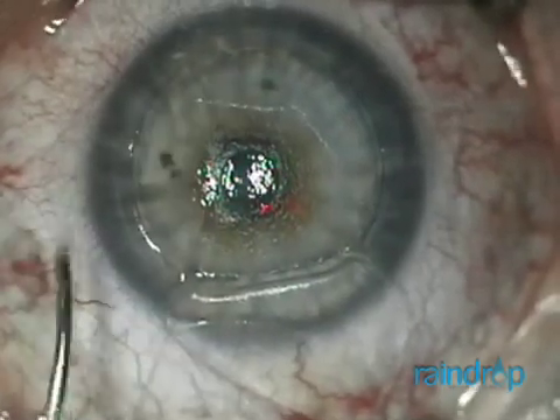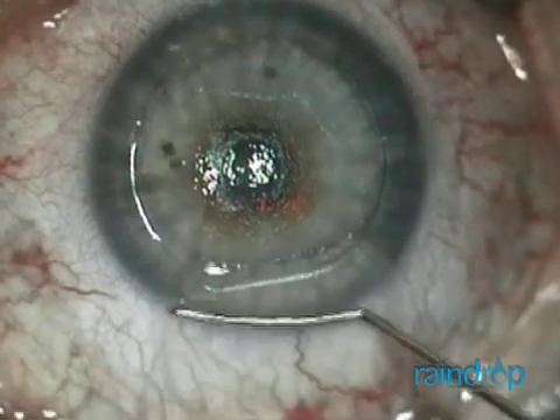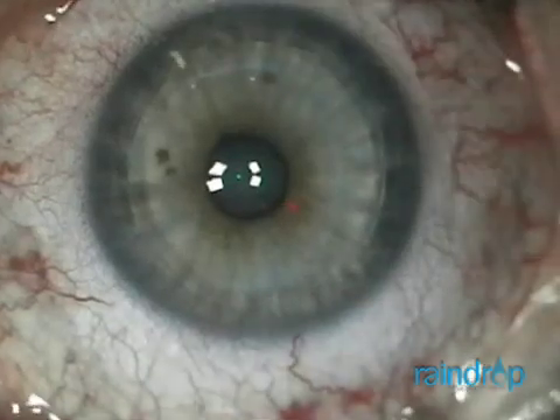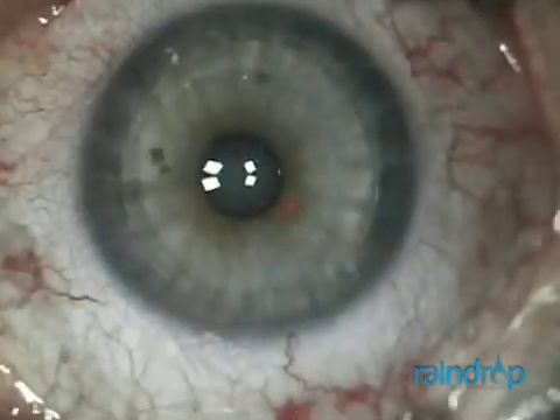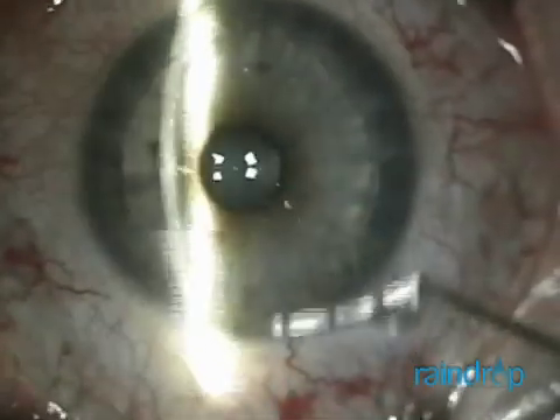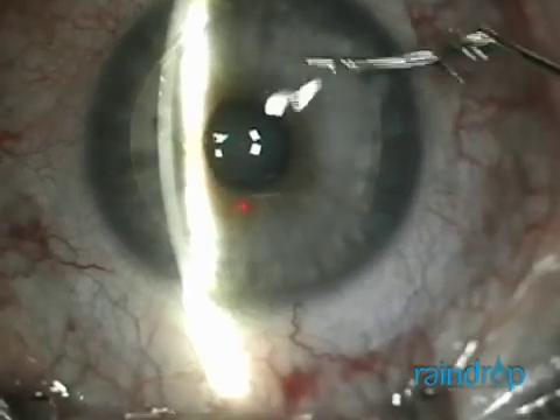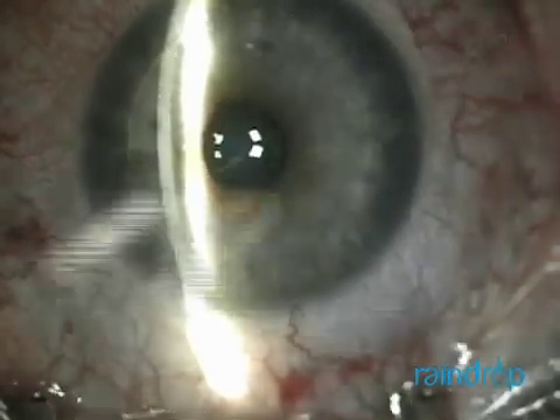You can see the Raindrop dimpling, and then in one smooth motion, I lay the flap back over the stromal bed and inlay. I check to make sure the flap is appropriately positioned and that the inlay is still centered over the constricted pupil.